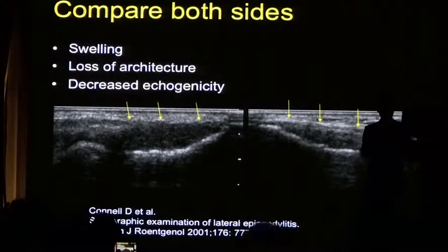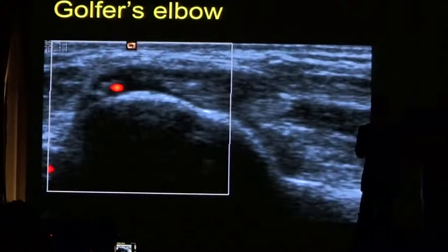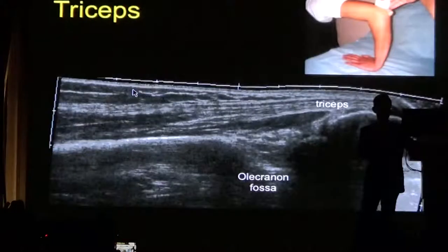Compare what you think is abnormal with the normal side — this is very important when learning to perform ultrasound. Here you can see swelling, loss of architecture, and decreased echogenicity indicating tendinosis. On the medial aspect of the elbow you have the common flexor origin, which is prone to developing golfer's elbow. Tennis elbow is on the outside, golfer's elbow is on the inside. Here you can see a hypoechoic region within the tendon with some increased vascularity on Doppler.